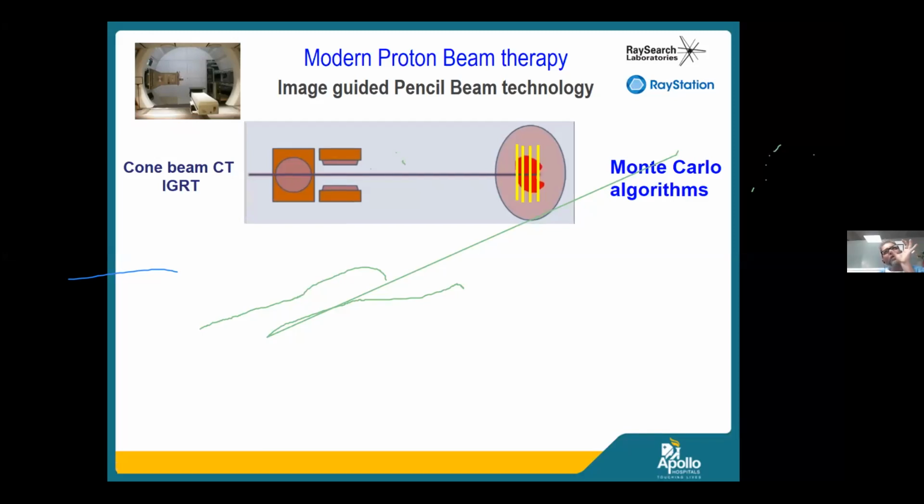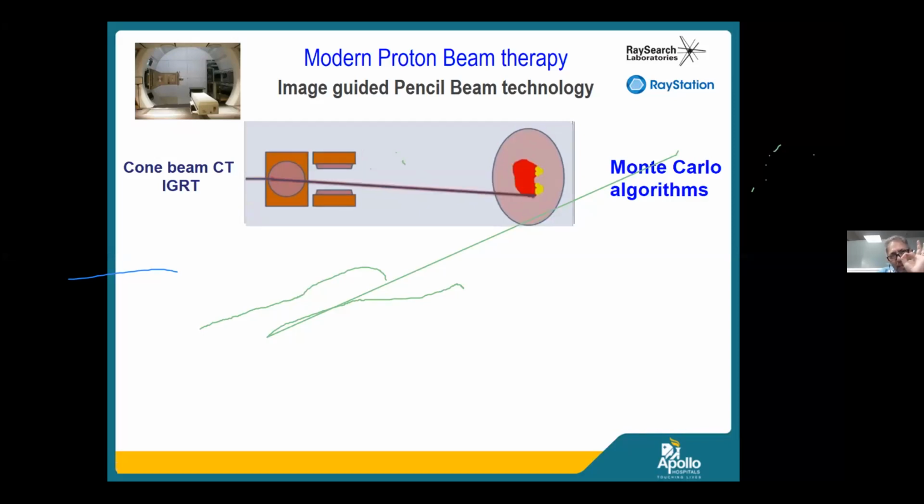It is not like a torch now. It is like a small pencil, and the pencil could be like a laser pointer that you have in your presentation. So compared to a big beam, there is a relatively small pencil. What this pencil does is, because it is finite and the spot size can be very small, it can be 3 millimeter, 6 millimeter. I have a slide later on the impact of spot size. So it's a tiny spot.